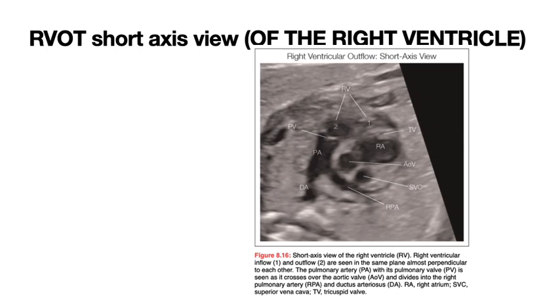All right, and why don't we see the left pulmonary artery? Well, since the ductus arteriosus is higher, if you've got the ductus and the right pulmonary artery in the same picture, you won't have the left. Remember that picture of my hand? You can't get all three things in the same view. You can only pick two, either the right and left at the bifurcation, or the ductus and the right pulmonary artery in this particular view.